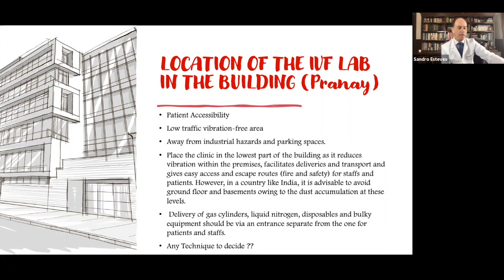So my advice for clinics willing to start a new lab or renovate a lab: get the technical expertise from one or more people if you don't have it, and then try to plan your infrastructure the way you want it to be 10 years from now. A common mistake is that people make the lab and the clinic adequate for today.